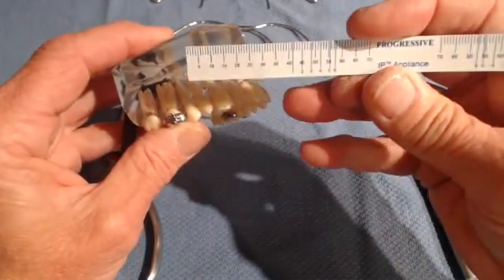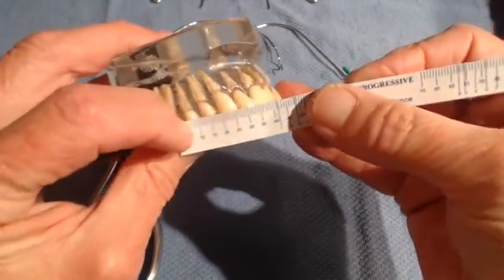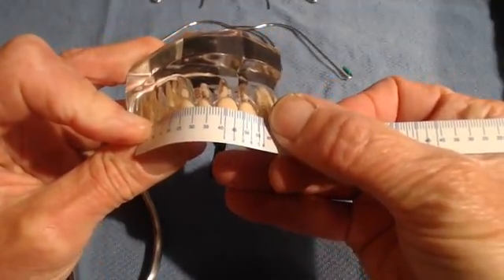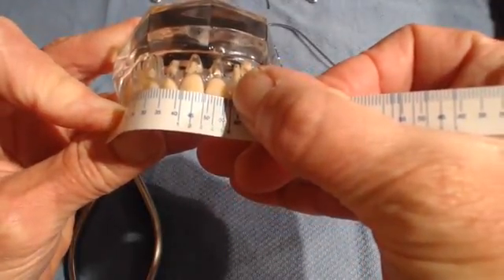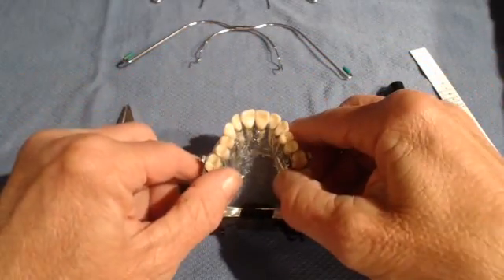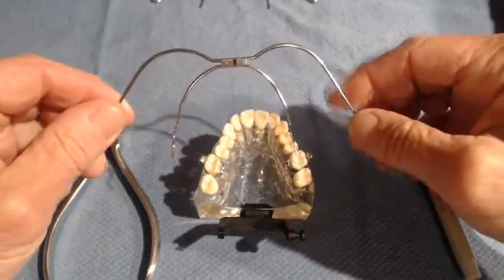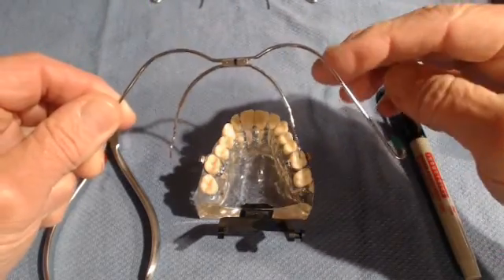Take your handy plastic ruler from Progressive and measure from the mesial of the tube to the midline over the brackets — this would be a size 3. If you go to your supply drawer and you only have a number 4, that still works; it's no problem as long as the inner bow doesn't touch the teeth or the brackets, you will be fine.